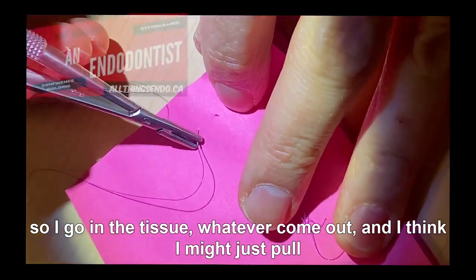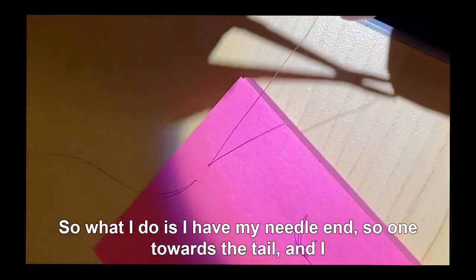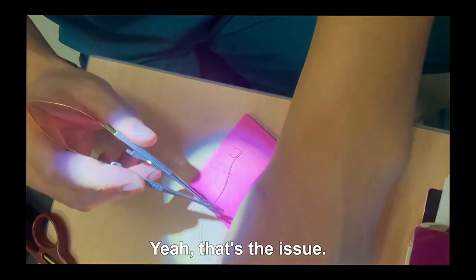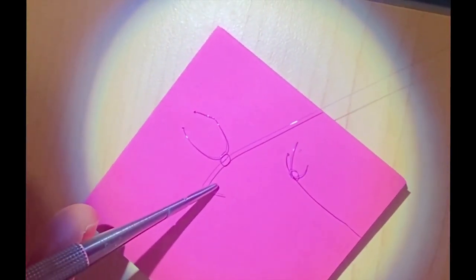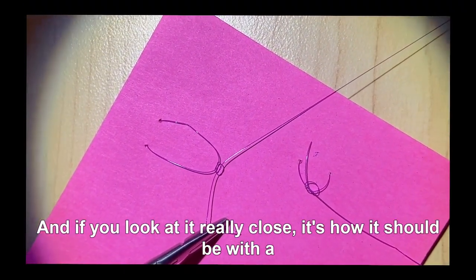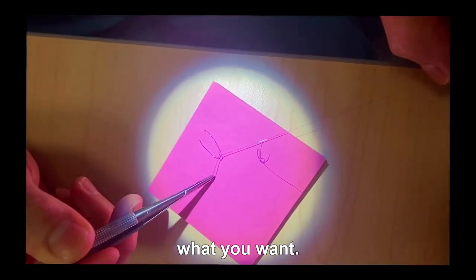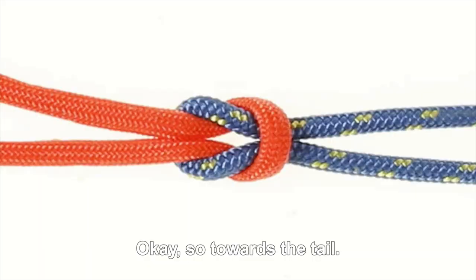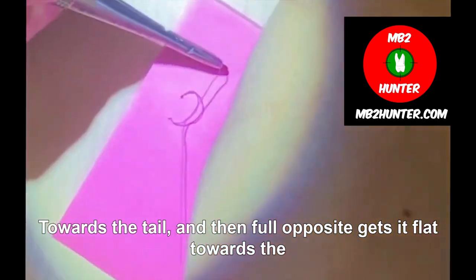So I go in the tissue, whatever, come out — I'm going to pull up some post-it notes to start so you can go through and see really easily. What I do is I have my needle end, so one loop towards the tail and pull opposite. That's flat — yeah, it's flat. And then again, put the loop in the middle towards the tail and then pull opposite again. See, that's the opposite. And that gives you the flat. If you look at it really closely, that's how it should be with a square knot.